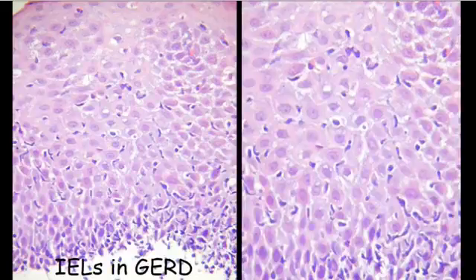And in the oldest literature on reflux, they talked about increased intra-epithelial lymphocytes, these little squiggly guys here, which are T cells. Now everybody's got a few of these towards the base of the mucosa and the esophagus, but how many is too many is something that all of a sudden people are paying attention to, because recently we've noticed that some patients that are biopsied to rule out eosinophilic esophagitis have lots of lymphocytes in their mucosa, and it's lymphocytic esophagitis, which I'll talk about in a minute. Suffice it to say that the old literature talked about having increased lymphocytes in reflux.